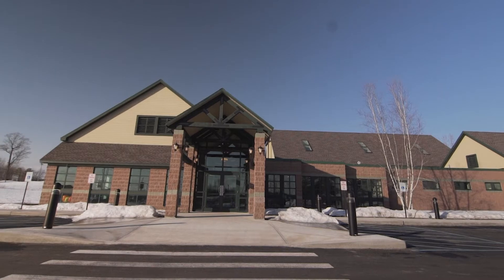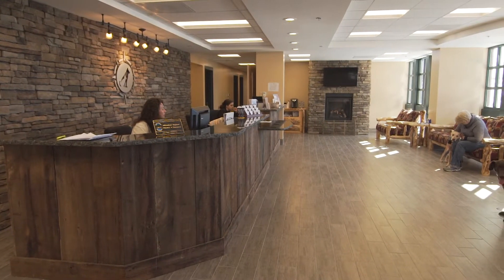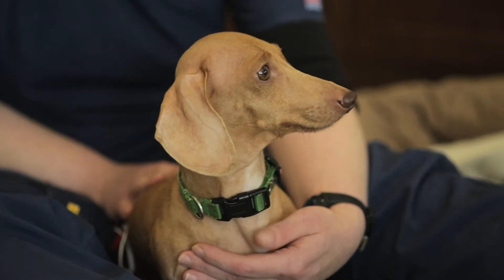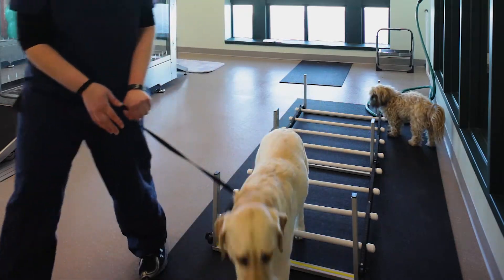My name is Matt Brunke. I'm a veterinarian here at North Country Veterinary Referral Center in Queensbury, New York. Here at North Country Veterinary Referral Center, when we have a patient who has an injury, we always want to work hand-in-hand between surgery and rehab.